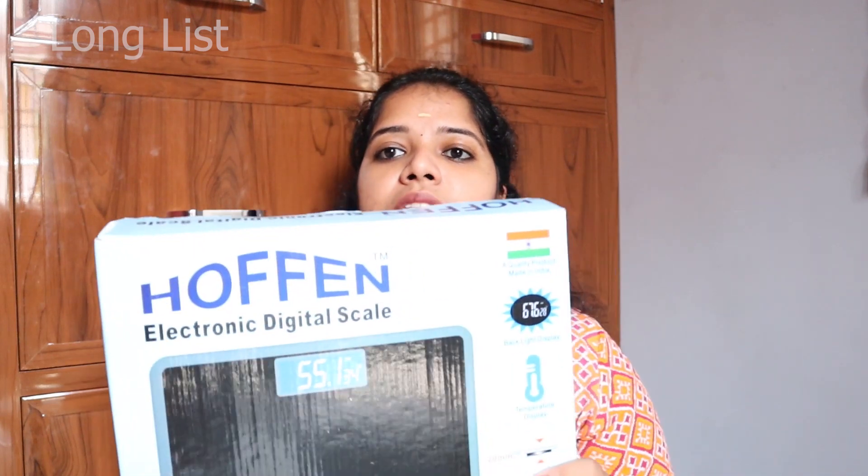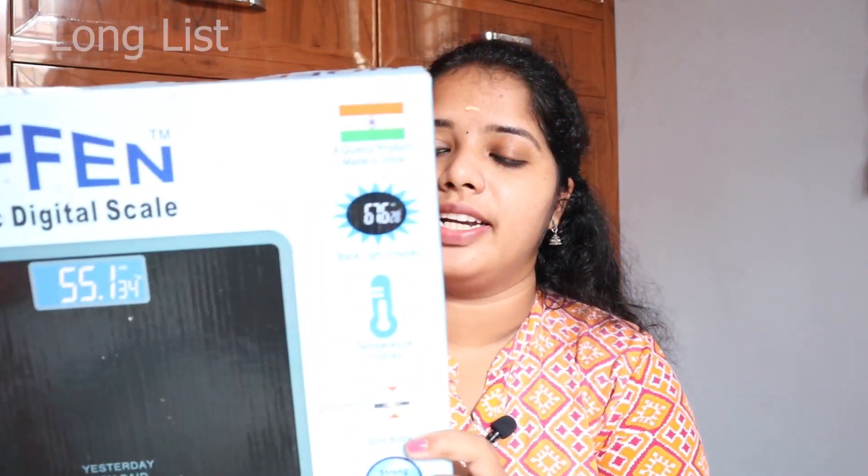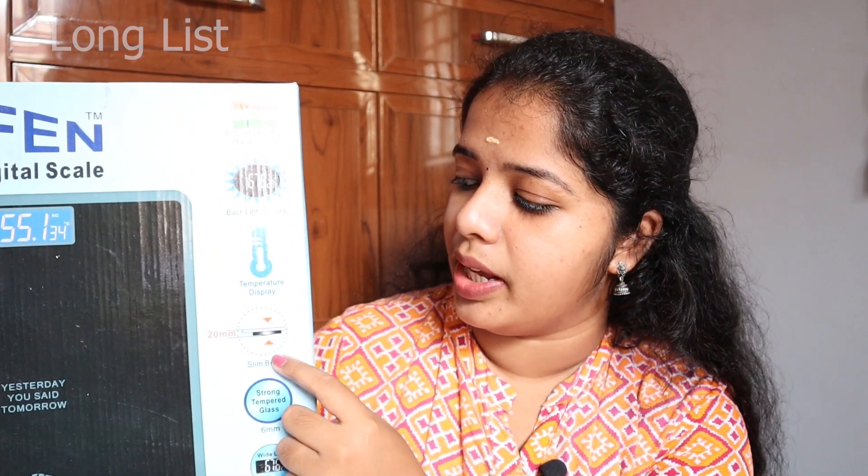Now let's see what is in the box. We are going to show the brand name. This is an Indian-made product. We are going to show the temperature on the scale. The body is slim, at 20mm.